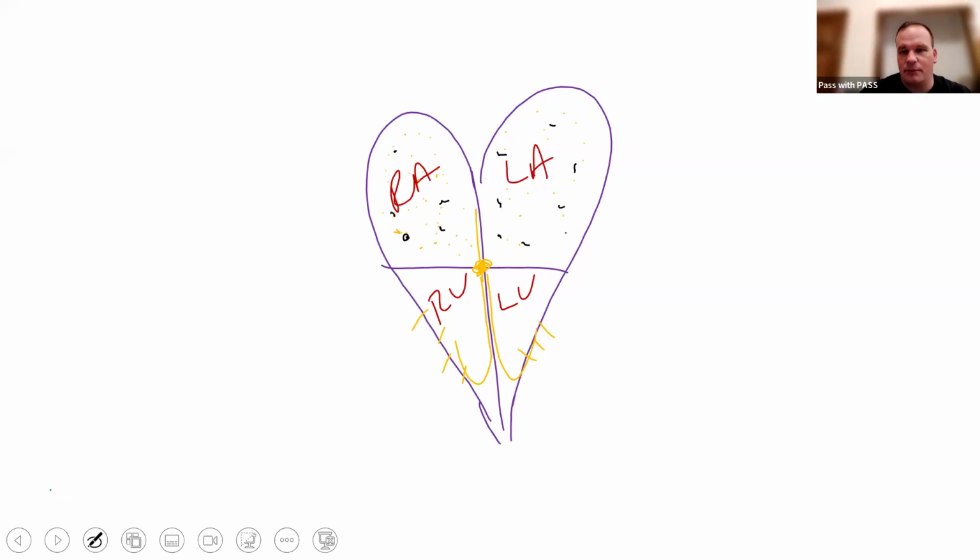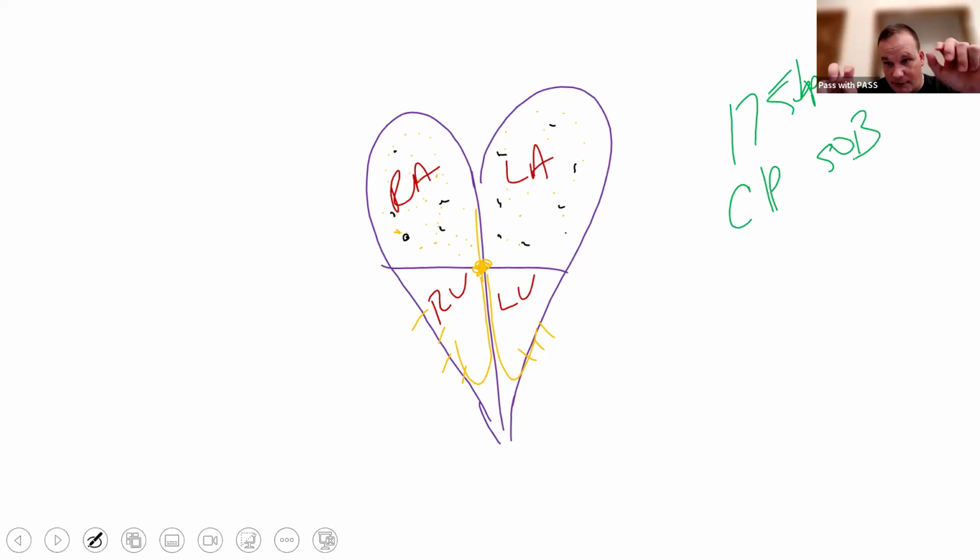This patient's presenting to me in the back of the medic unit. Their heart rate's 175. They're complaining of some chest pain and some shortness of breath, right? They're not doing great, but they're okay. Just complaining of chest pain and shortness of breath, which by definition is unstable. But let's say they're perfusing okay. Let's say their pressure is 110/50. All right. So technically they'd be unstable. Technically, they would need to be synchronized cardioverted.